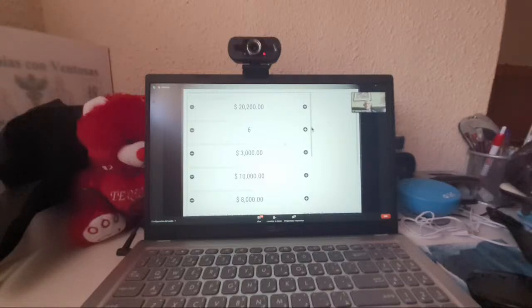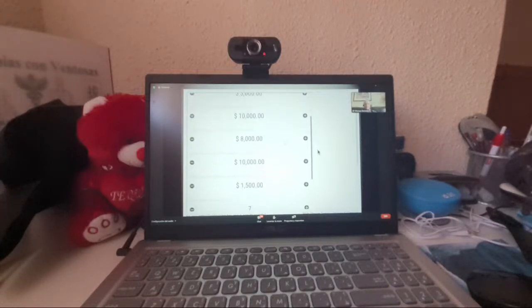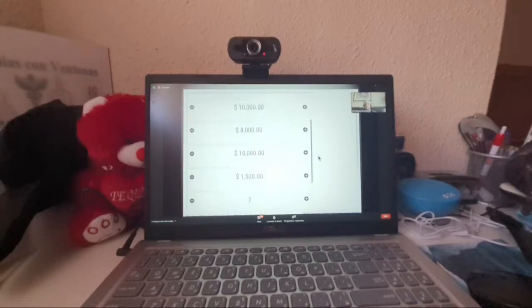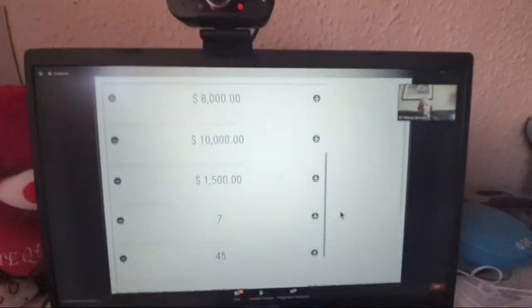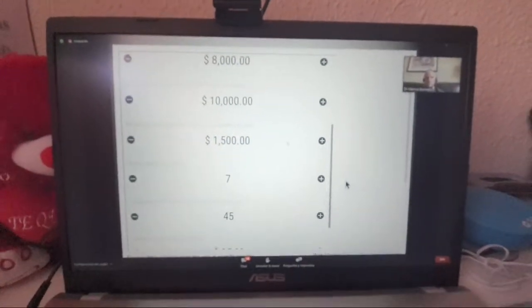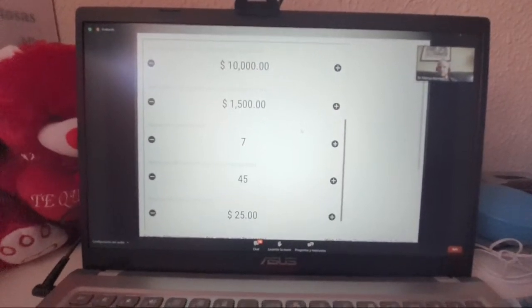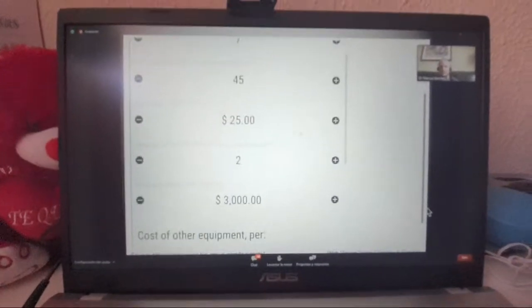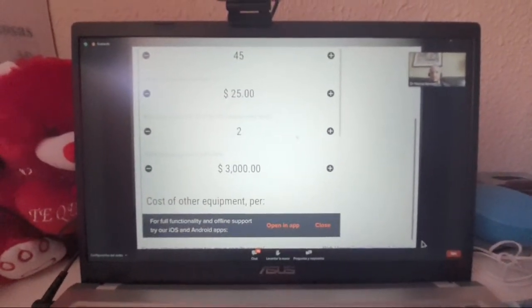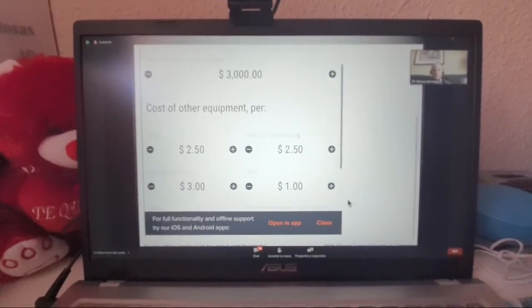You have to purchase the video processor and light source, storage equipment, and disinfection equipment. Then there's the maintenance and storage per year and disinfection equipment per year. Scopes depreciate over time. Then there's the time that staff spend cleaning them and the hourly cost of your staff, and you can then get a calculation of how much each procedure costs.